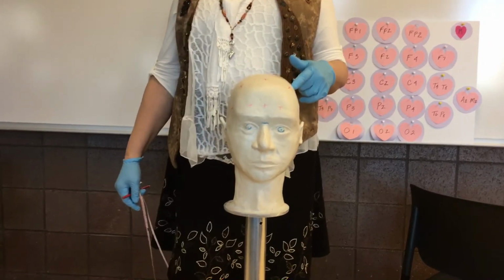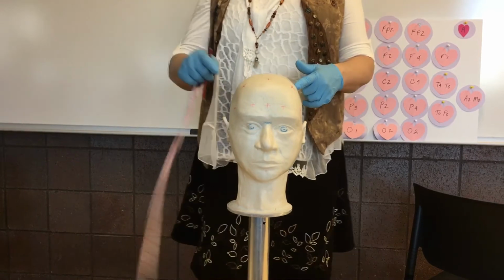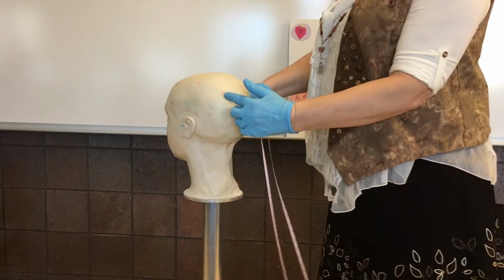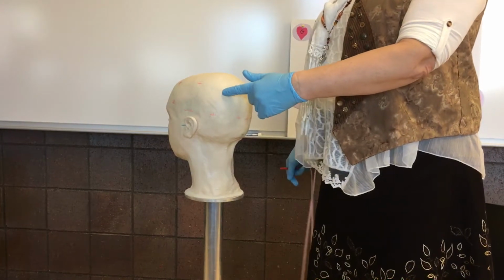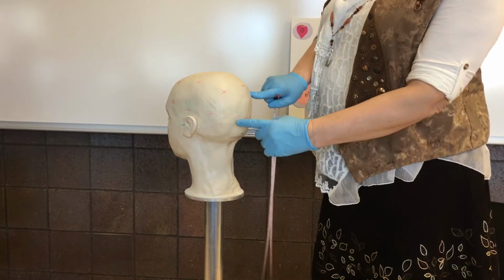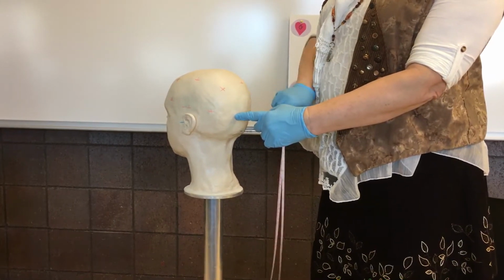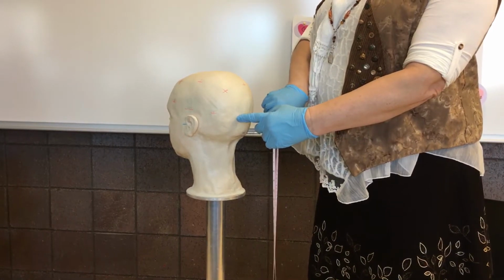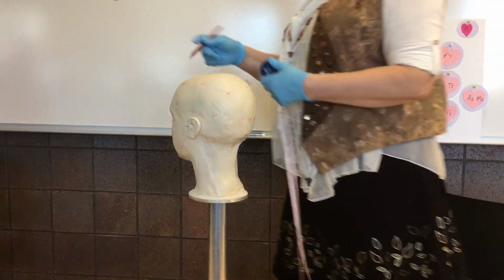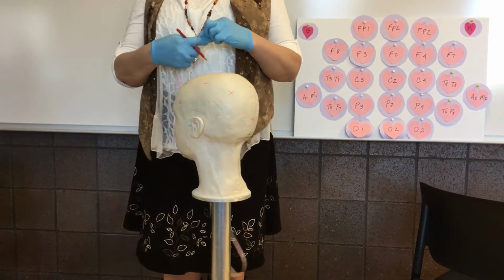What's this electrode here on the left? C3. The homologous electrode on the right is what? C4. What's this electrode here from the parietal lobe on the left? And the homologous electrode? Now we're in the occipital lobe in the back on the left. What's that one? O1. What's the homologous electrode on the right? O2. So the distance between these measurements should be equal from side to side.